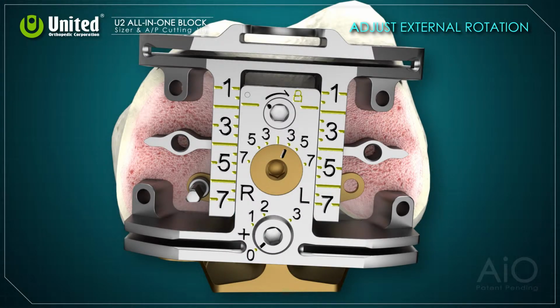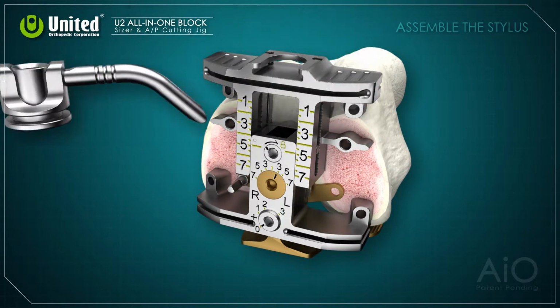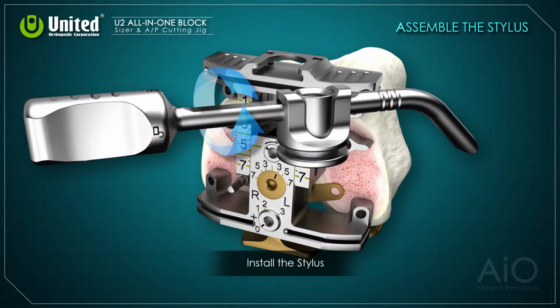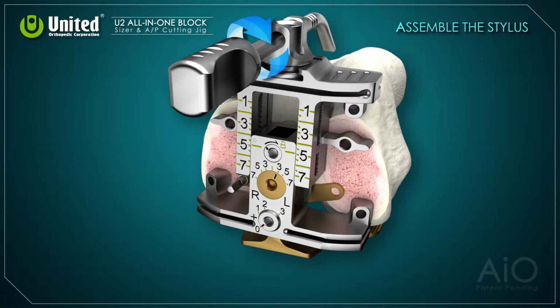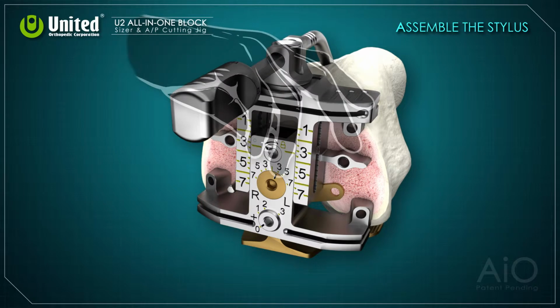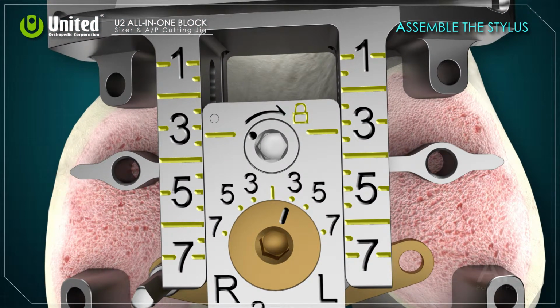Next, assemble the stylus. First, rotate the stylus handle to unlock position. Then, insert the stylus base onto the socket on top of the all-in-one block. Position the stylus tip so that it just makes contact with the lowest point of the anterior femoral cortex. The femoral component size will now be indicated on the main panel.